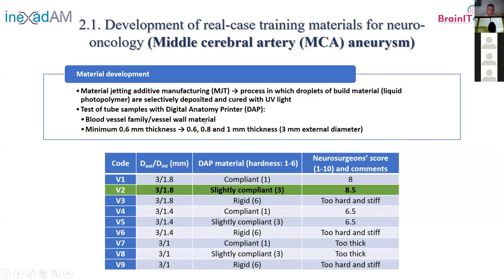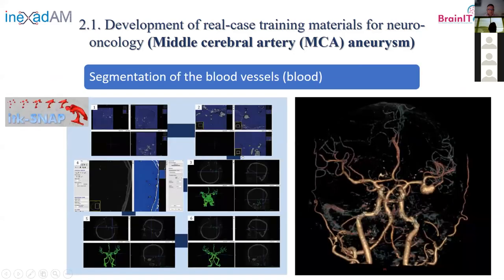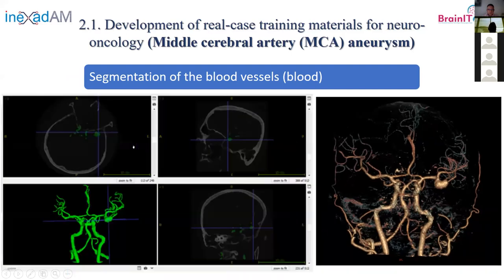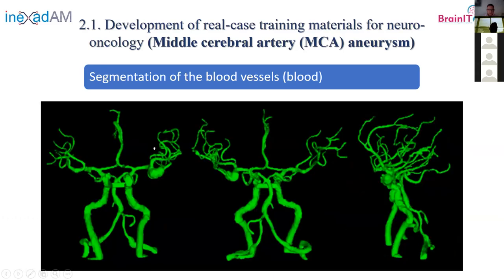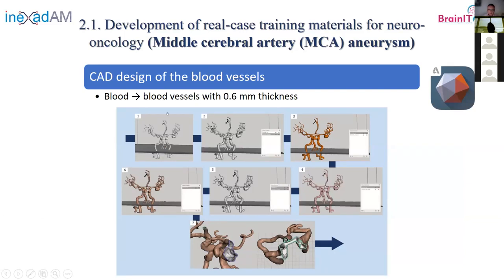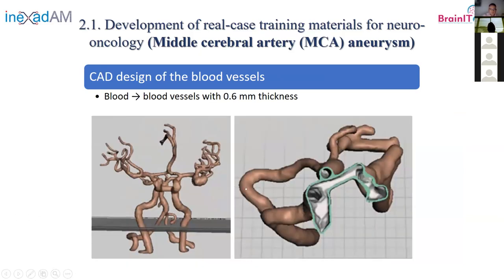With that combination, we did segmentation from the available images using the ITK-SNAP software. We had only a static picture as reference because from that imaging we could not directly obtain a 3D model, so we had to redo the segmentation. The segmentation process focuses on the blood — you obtain the blood volume, not the vessels themselves. After that, we used MeshMixer software to add the 0.6 mm thickness and create the hollow vessel wall.